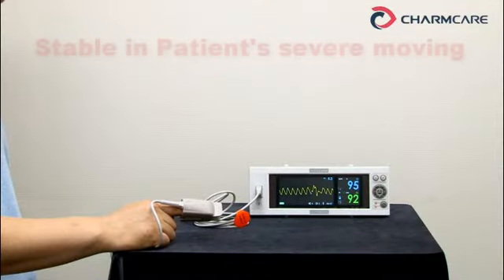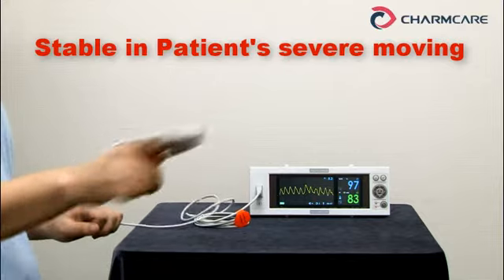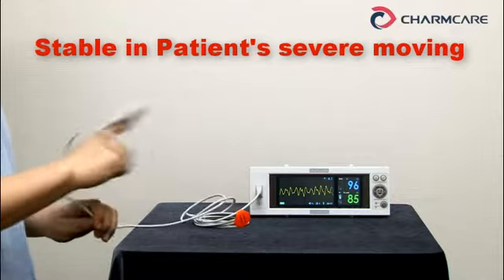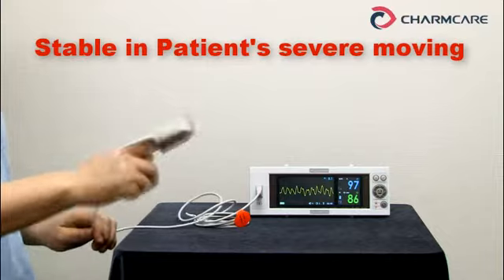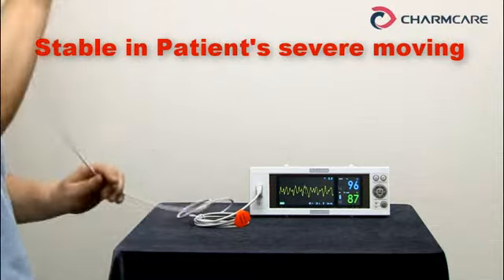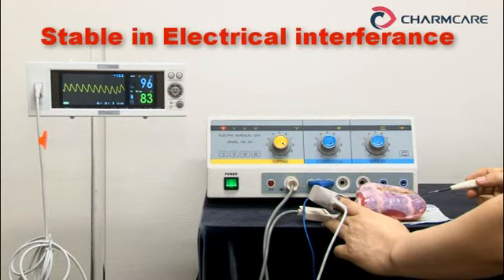I'd like to show how our measured values are stable even when a patient moves severely. I'd also like to show how our measured values are stable even in case of using ESU — electrical surgical unit.